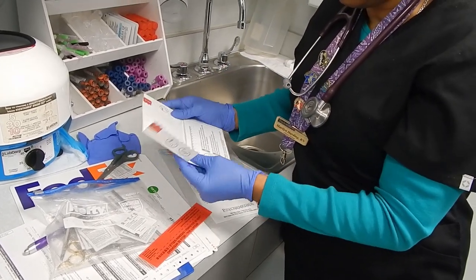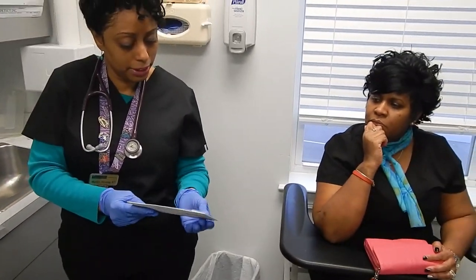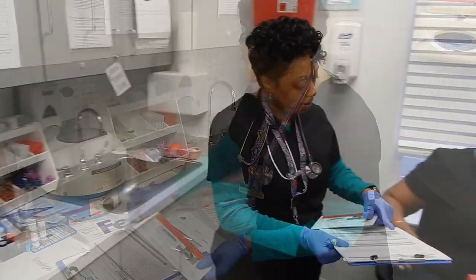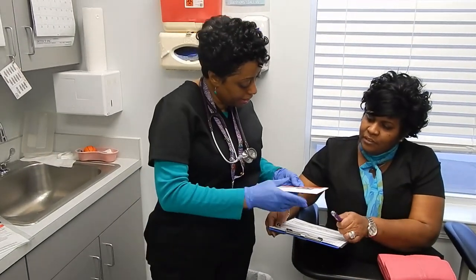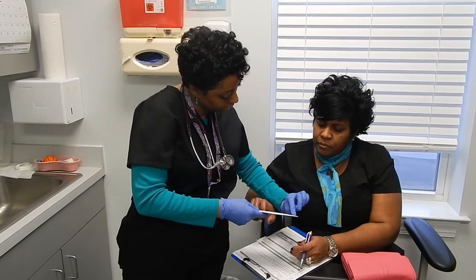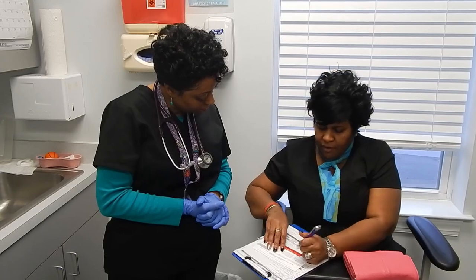This goes in there like that. I want you to see that I'm sealing the hair specimen in front of you. I'm actually going to need for you to complete this section here as the donor. And here, where it says subject initial, I need you to do your initial.